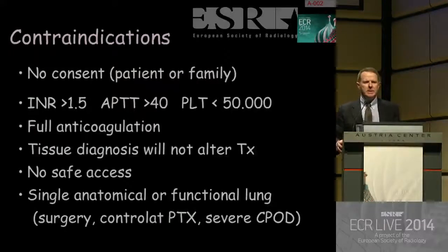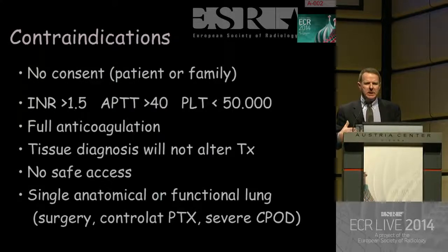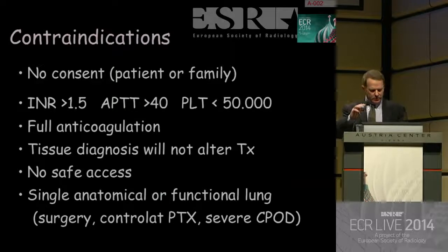First of all, the main problem is the coagulation status of the patient. And of course, you can change it a little bit. You can use a small needle. If the patient is on full anticoagulation, you stop it. Or you may decide that there is no indication because the diagnosis that the clinician is asking for will not alter the management of the patient. In that case, you're allowed to say, I'm sorry, I'm not going to do a procedure which is at risk of complication if the diagnosis that we are going to make is not going to alter the treatment of the patient. Of course, if there is no safe access, that comes for sure.